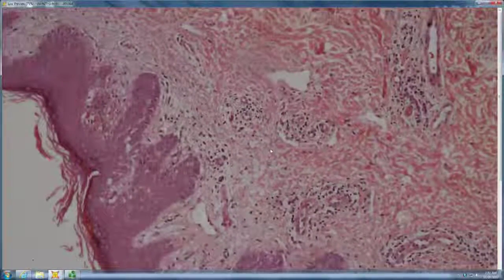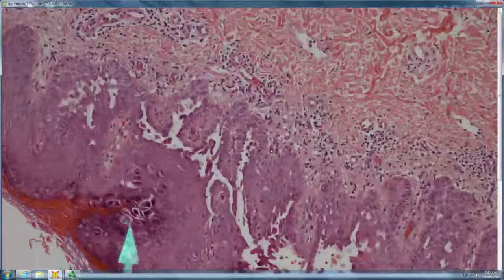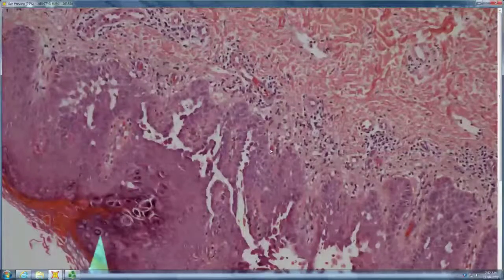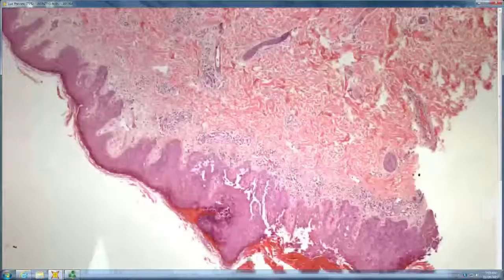Similar pattern here, a lot of acantholysis and dyskeratosis, seeing some distinctly blue and clear rings. So I was thinking of a warty dyskeratoma, it does look kind of isolated, or Darier's, or Grover's, because it's very small. What if I told you this was keratotic lesions of the groin and crural area in a female? Vulvar dyskeratosis, vulvar crural, it goes under numerous names.